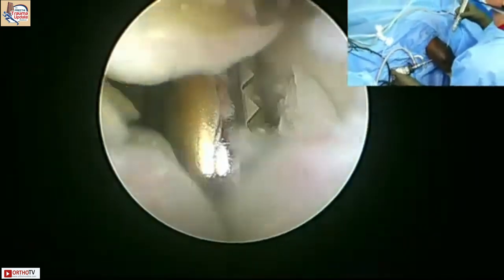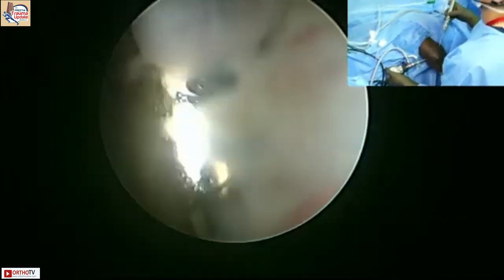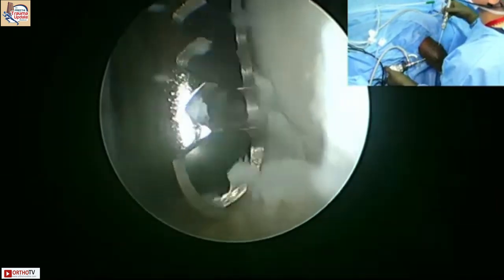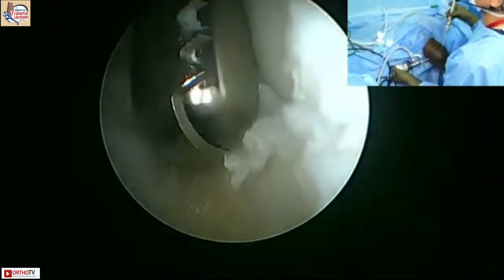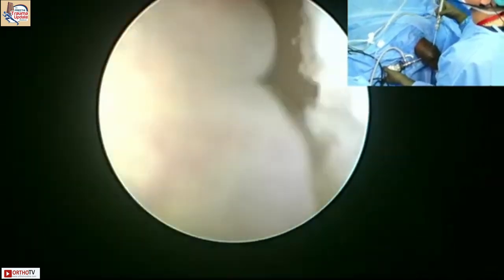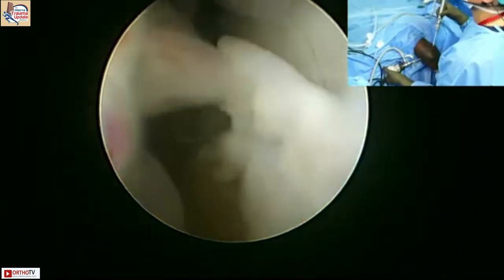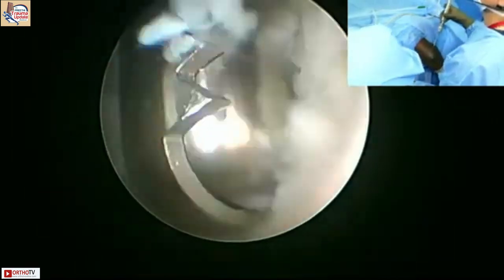Suction, I would need. So, just hold it there. This is suction. The capsule keeps covering on me, and I think I am wasting some valuable time here. Right, go on. Suction.